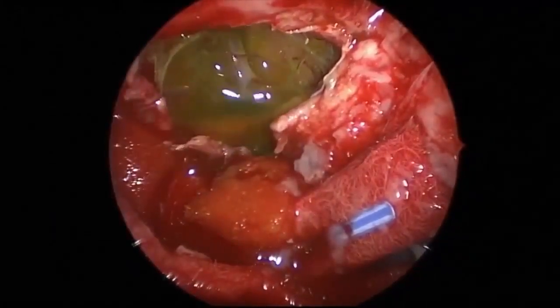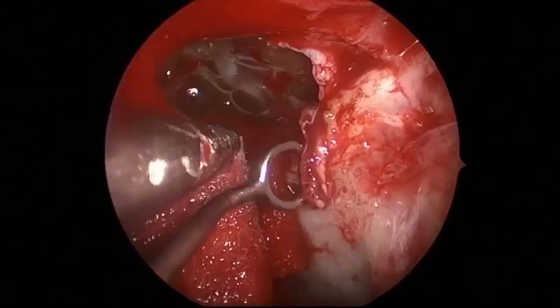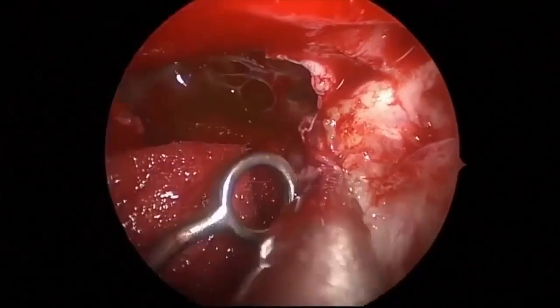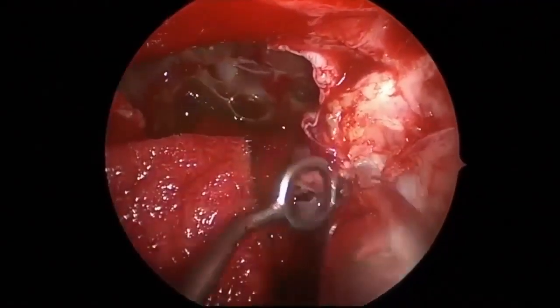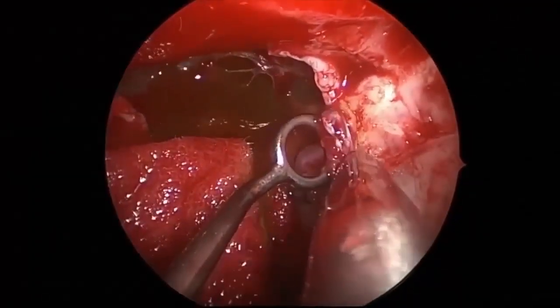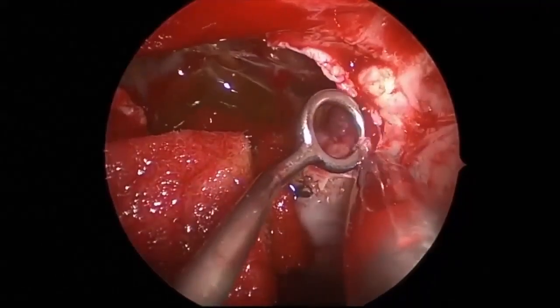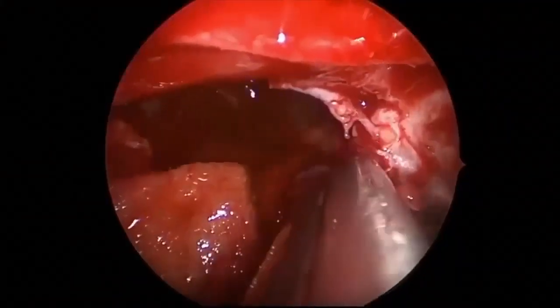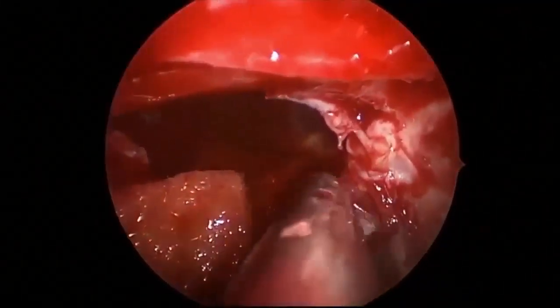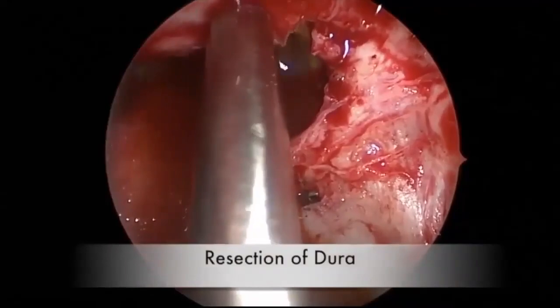tuberculum region. The optic chiasm, left A1, A2, right A1, A2, and left optic nerves can be identified. The tumor invades the medial optic canal on one side. This area is opened up. One can observe the ophthalmic artery as it extends into the medial optic canal, and tumor is rolled out. Kerrison is used to grab and remove any tail of tumor extending into the medial optic canal.